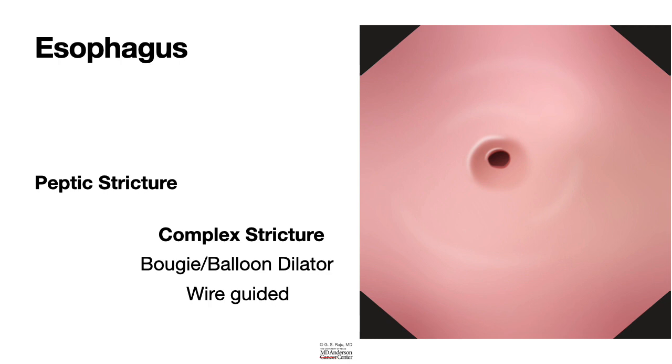So now in the next session, we will talk about how to use a bougie dilator.